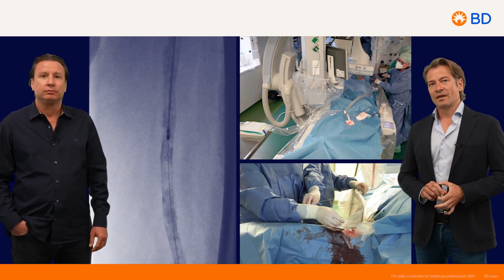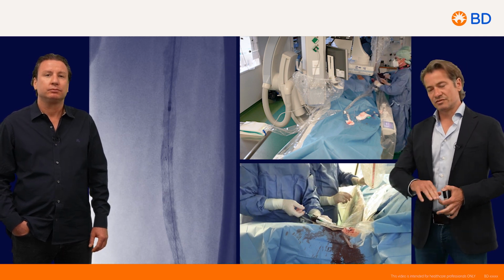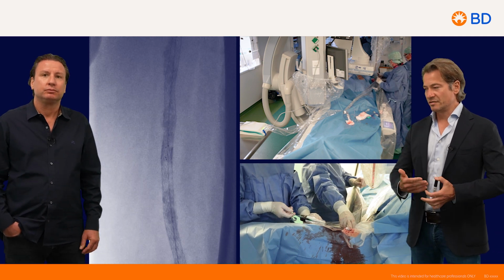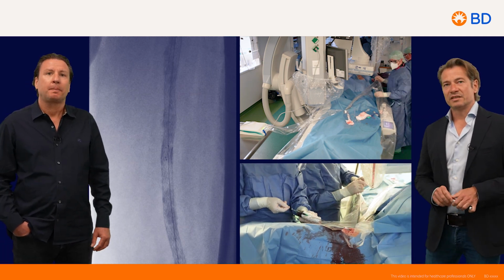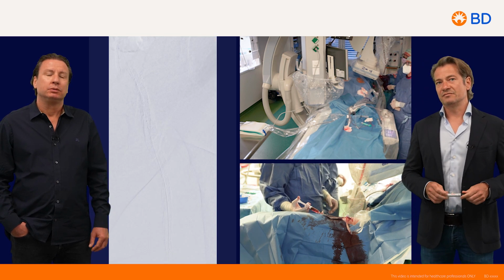And maybe here it's not so important compared to the crossover approach to have it always in movement, but you can also heat the device here when you don't move it.